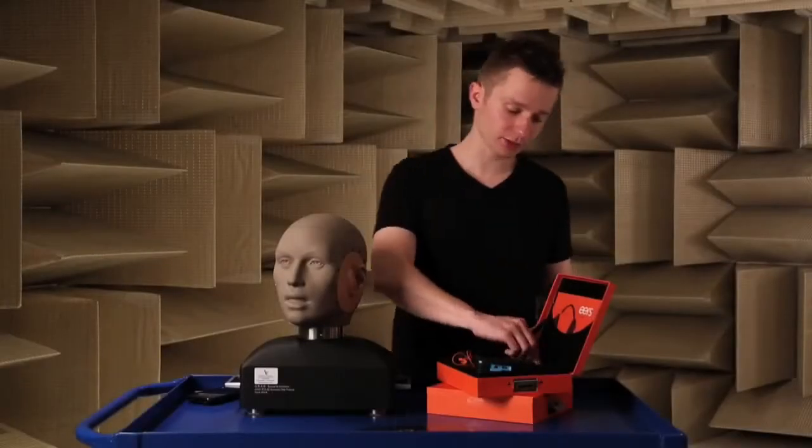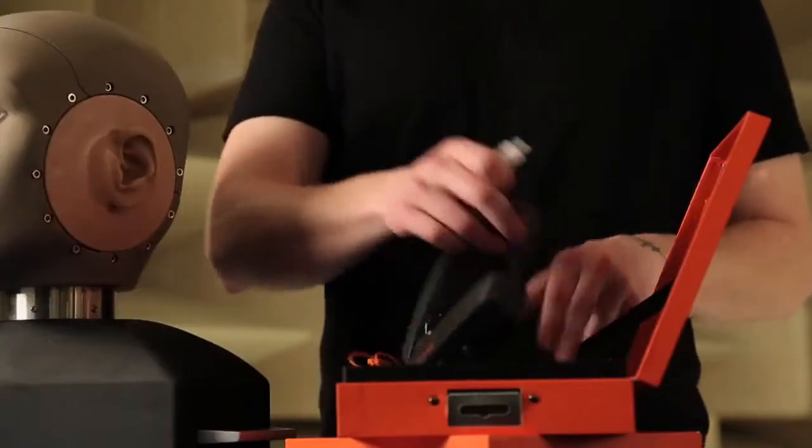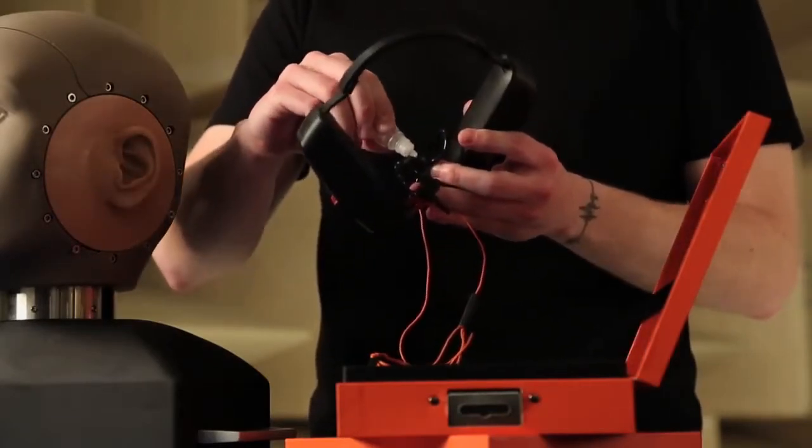The next step is to grab your fitting solution and apply two drops to each earpiece. Spread it around evenly and avoid the center hole.